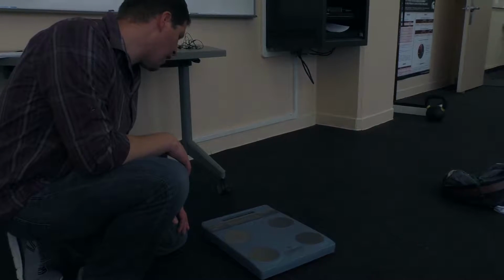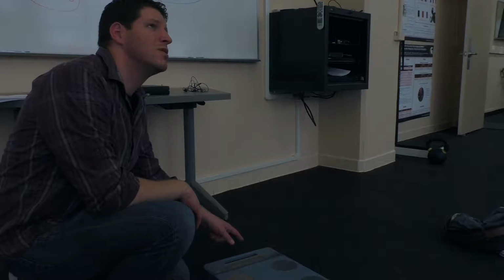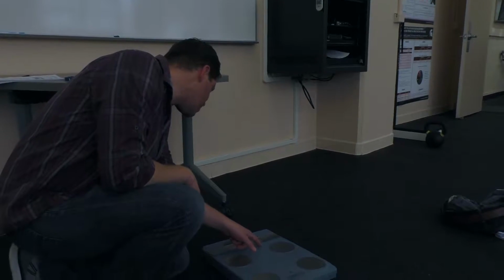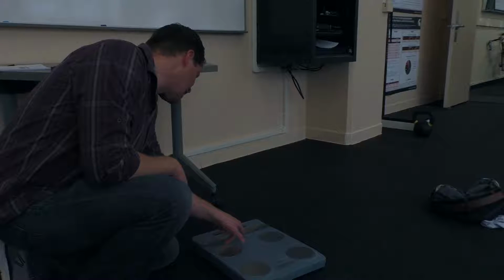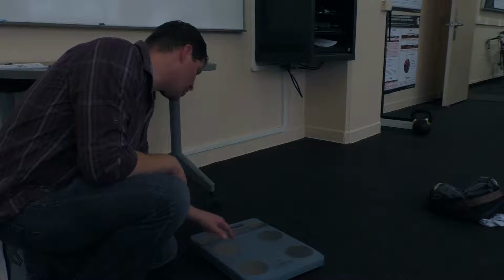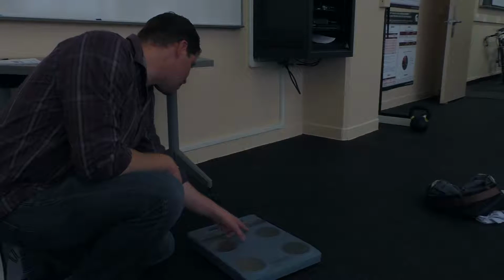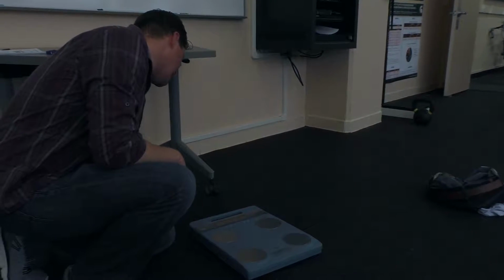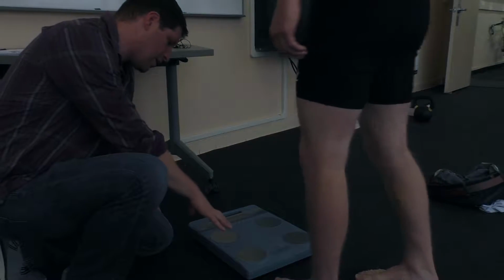Okay. And we're going to put the height in, which was in inches. About how tall are you in inches? 5'11". That's 71. 71 inches, okay. So we're going to raise that up to about 5'11". As you can see, this is meant to be extremely user-friendly to the point where you question some of the assumptions the device makes. Then we're going to ask the participant to step on, obviously, bare feet so we can have a good conduction. Yep. And all of a sudden, boom, up comes the percent fat, 8.5%. Go ahead and step off.